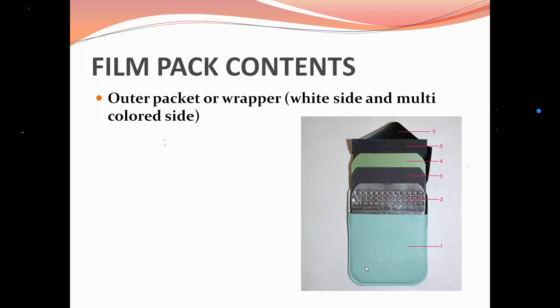You can see that the company's name is written on it. And I'm sorry, I couldn't find a better picture where sometimes it is also written what is the speed of the film. But I'll come to that in a minute.